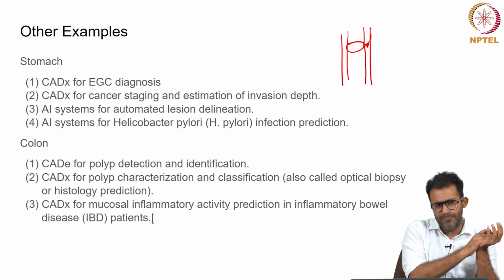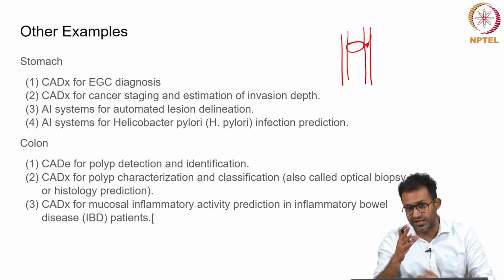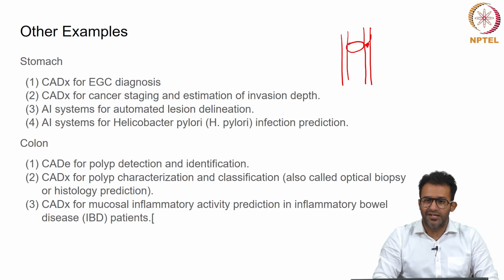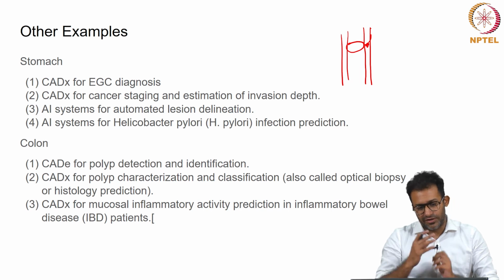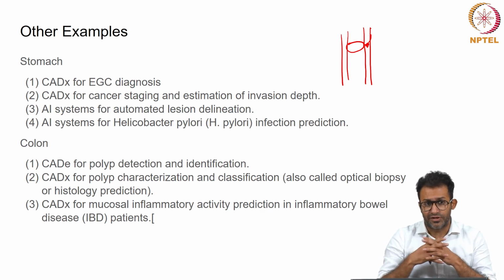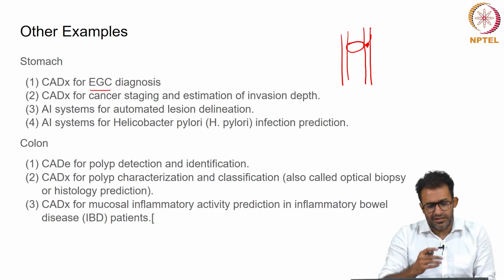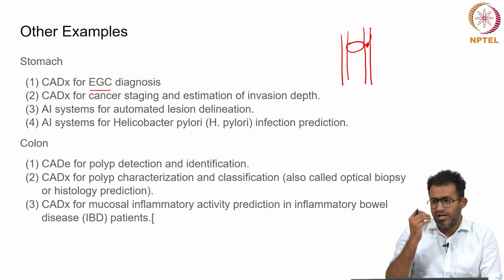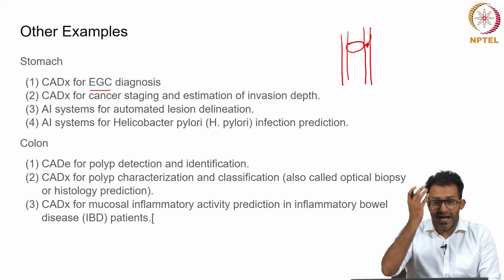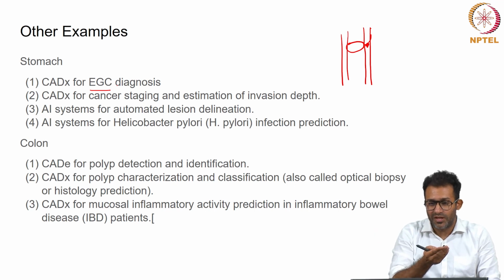Much of the research in endoscopy has been done in Japan, which has a very effective screening program for early gastric cancer. So, the tradition in Japan is that on the 30th birthday, everybody gets an endoscopy done for diagnosis. So, much of the research has been performed in Japan especially for gastric cancer, what we call the EGC, early gastric cancer, and there is computer assisted diagnosis for early gastric cancer diagnosis. If you have an early gastric cancer diagnosis, you can treat it by endoscopic mucosal resection, where you go through endoscopy itself and can remove the cancer and come out.